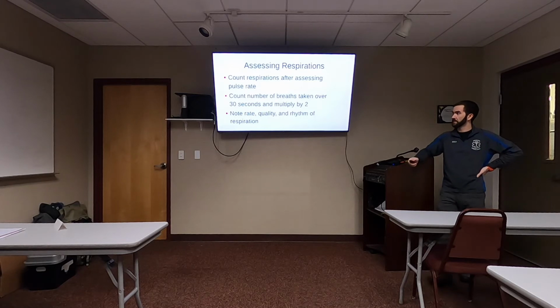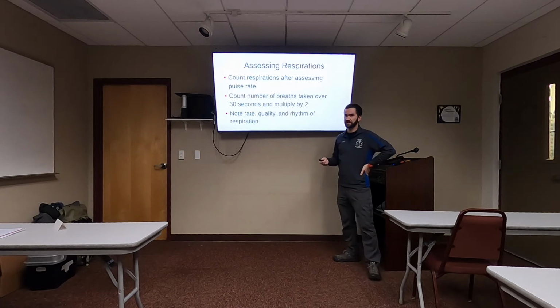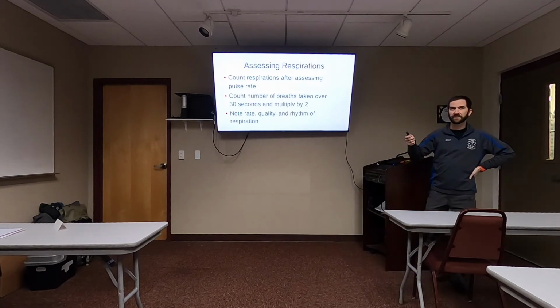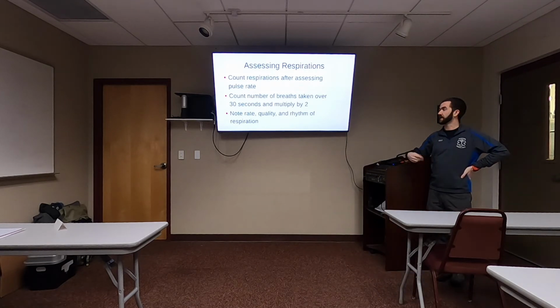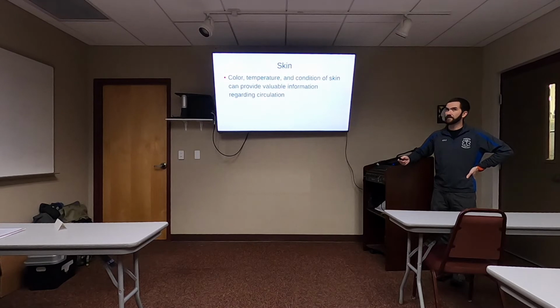So they breathe in normal, in deep, in shallow, and pretty much all we're going to see is people breathing regularly. Occasionally you'll have somebody that's kind of having anxiety issues or something and breathes real fast for a little bit and then calms down, but it's not super common.